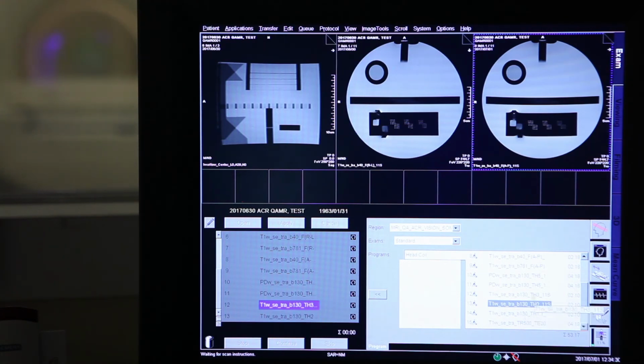Yeah, of course. The other ones. This is the 1.1. Let me check, what is this? Yeah, I'm playing here. Alright. You want to make them down? No, make them down, right? Alright, let's check this.